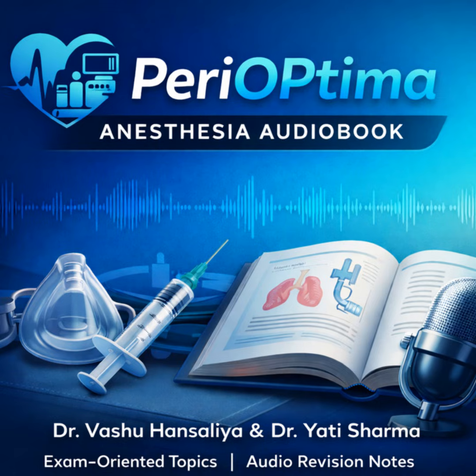We've talked about many systems that prevent the creation of a hypoxic mix, but there's only one that chemically verifies the result. That is the oxygen analyzer, and its importance cannot be overstated. Why is it so critical? Because it provides essential continuous electronic monitoring of the final inspired oxygen concentration, the FiO2, right near the patient's airway, regardless of any upstream machine errors. So even if a cross-connection has bypassed all the other safeguards, or if there's a massive leak, the O2 analyzer is the only thing that confirms the patient is actually inhaling a safe oxygen level. Its alarm is typically set around 30% FiO2, which gives you a warning before hypoxemia can even develop.